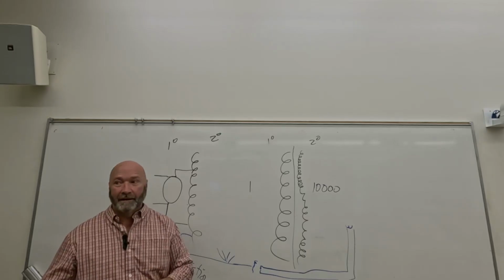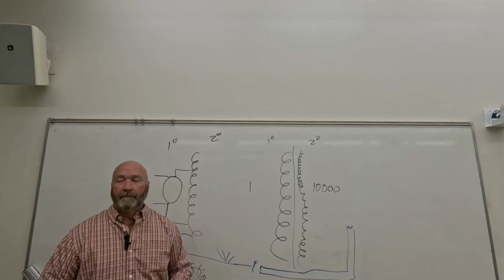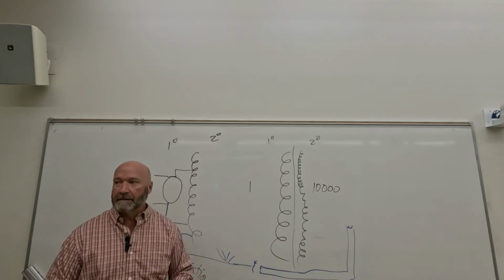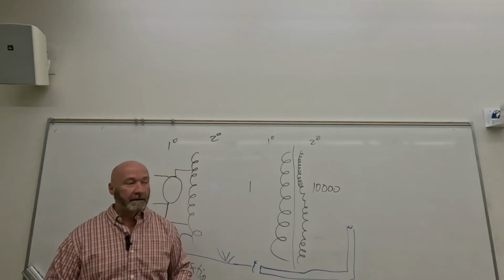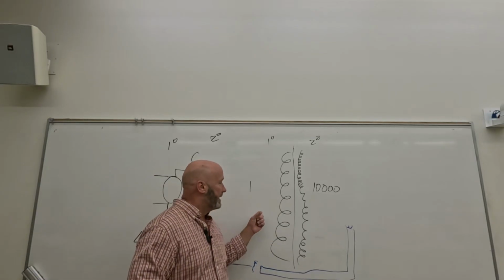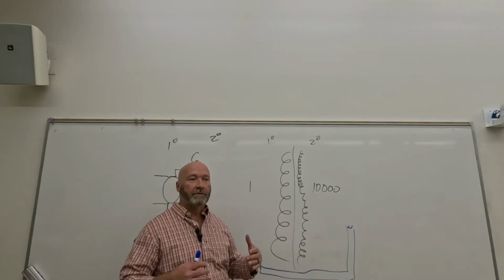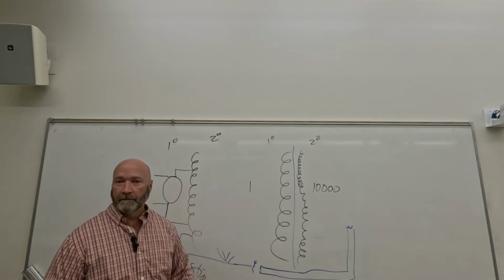There's going to be labeling on this test, and it's not going to be that particular diagram, but if you know all the components, that diagram is going to work just fine for studying. Just know that on my test, it's low voltage, high voltage, filament circuit, so there's no confusion about where the step down transformer is.